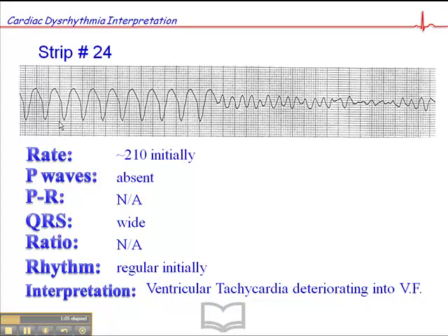This is a common terminal event when patients experience sudden cardiac death. They may go into a pulseless ventricular tachycardia, which deteriorates into ventricular fibrillation. These patients will definitely be apneic, unconscious, and pulseless in this VF section. But when you see VT preceding VF, chances are good that they were pulseless in the VT section as well.